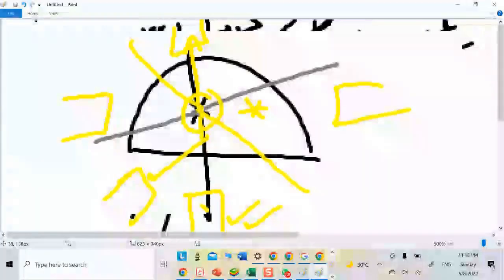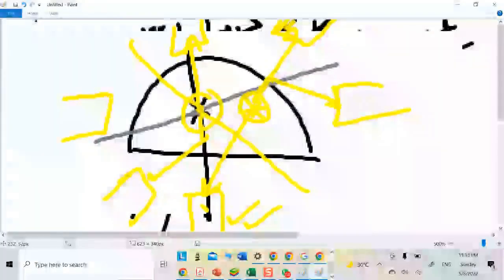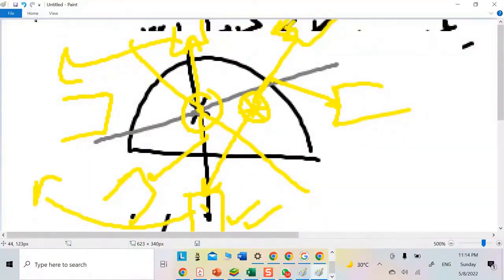Now, the leg next to it has radioactive material, which will emit gamma photons in all directions, as we agreed. So, it is expected to emit a photon like this, and another photon, for example, like this, which went to this crystal. So, something like this happened. It underwent Compton scattering and moved like this. So what happened is that I now have two detectors. They received two gamma photons, both at 511. But the two came from different places, right?